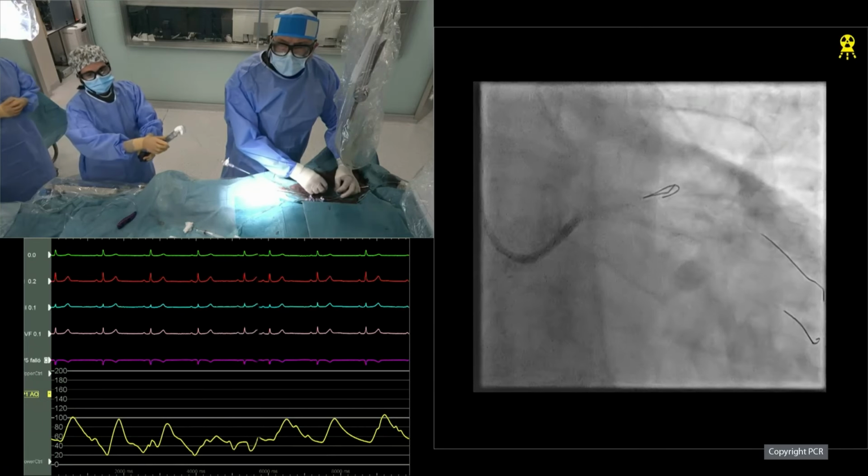That was the OCT confirmation of the distal rewiring of the LAD before doing the kiss. Yeah, we did not do it. We have done it on many occasions, but in this particular case, we thought that on angiographic grounds we were doing it quite all right. I don't know if everyone ensures with imaging that you are crossing through the right cell, but in this particular case, we did not think it was crucial.